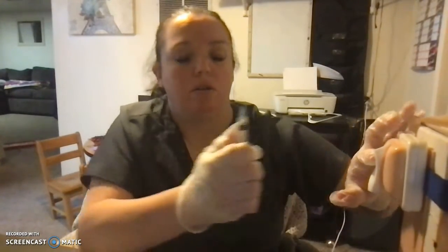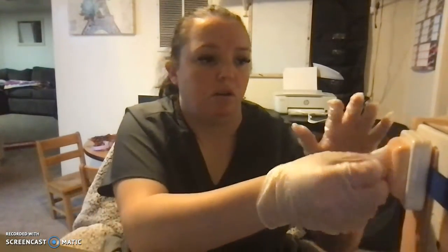I'll cover it with a gauze pad. I will not massage the area. Activate my safety, discard into a sharps container. Ensure that my patient's doing okay. Remove my gloves, get rid of my supplies. Perform hand hygiene again and document the procedure.